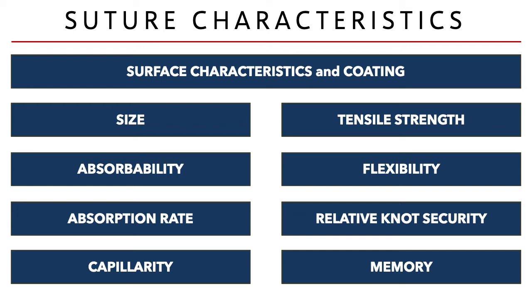For example, yung mga binebentang Christmas wrapper, okay? Di ba nakabilot na yan? So those have actually good memory, because even if you unwrap them from the pagkabilog, hindi siya nagfa-flatten agad. So the same characteristic as sutures. Some are manufactured looped in a certain way, and it's quite hard for them to forget the way that they were manufactured. And it's sometimes hard for us when we use them already and we want them to be straightened out.